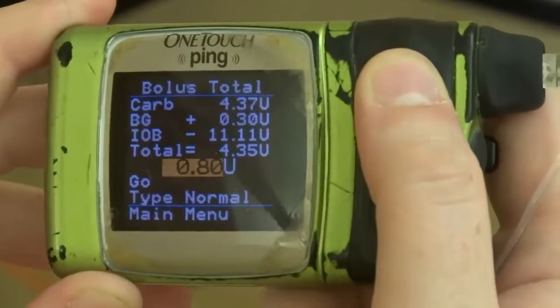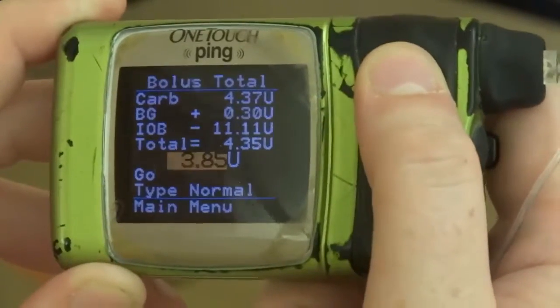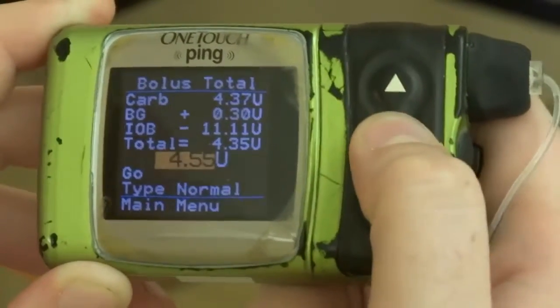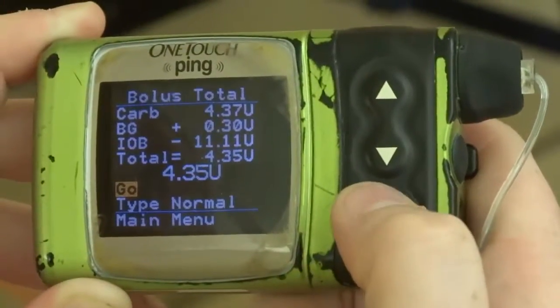For the Animus you have to dial up 4.35 — you can't just press okay. It's just kind of a safety factor. Then you press okay and press okay again to give it.